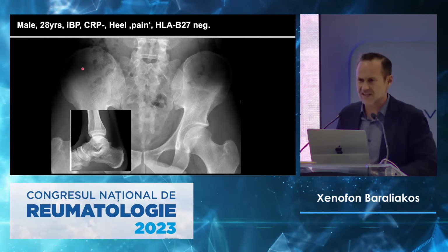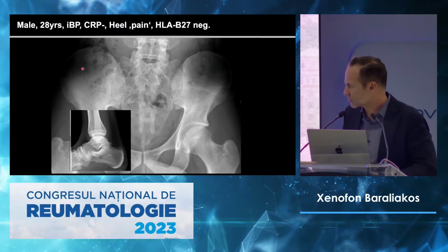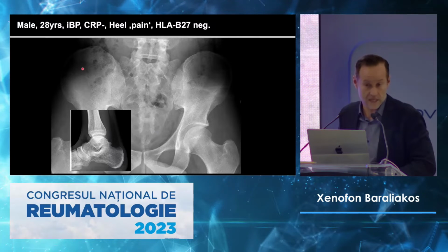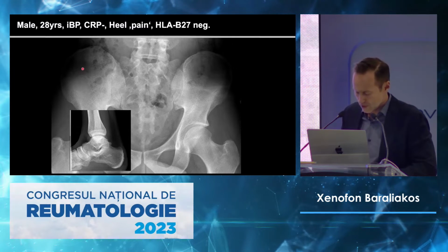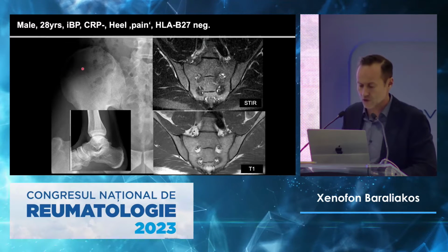So the heel was okay. There was nothing to see. There was just some tenderness. I didn't really put much weight on this. He was doing some sports, but otherwise he was healthy. And then, of course, we went on to do an MRI, and this is what we saw.